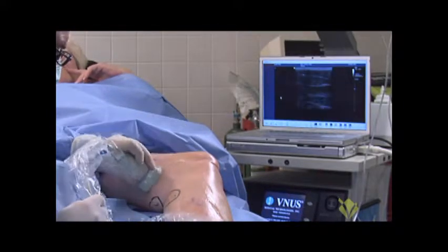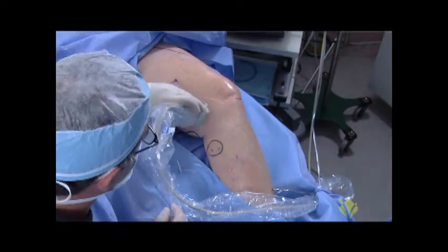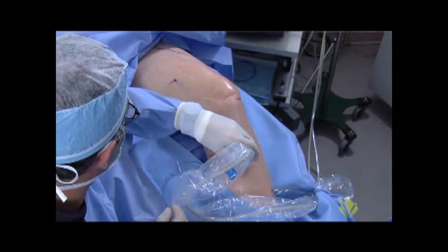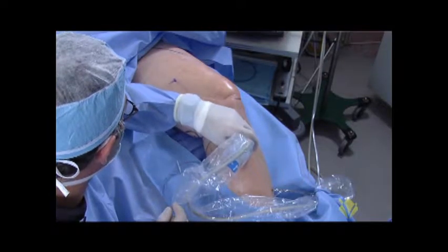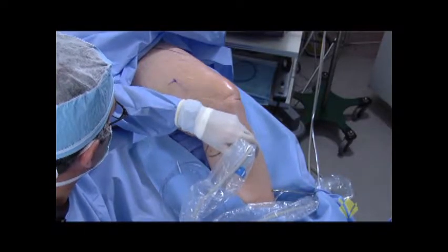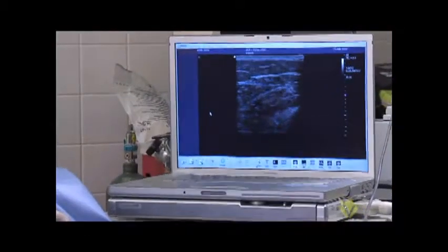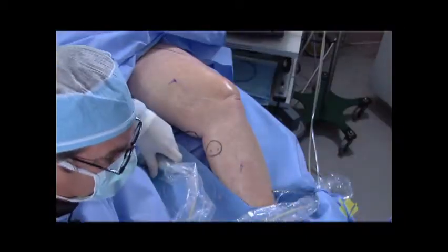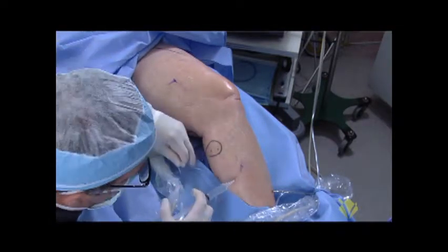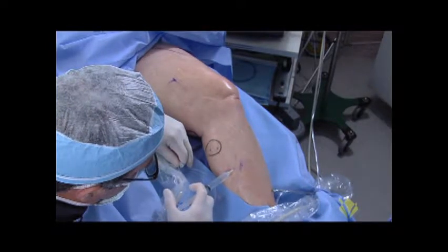The question sometimes comes up: where do you choose to make your entry point — above the knee, just below the knee, or in the mid calf? What I'll do is scan the patient to see where the last main side branch is coming off the great saphenous vein, and I'll try to enter the vein just below that so I can ablate that segment as well, reducing the chance of a perforator or collateral branch coming in and re-feeding the distal segment. We'll enter in the mid calf here.